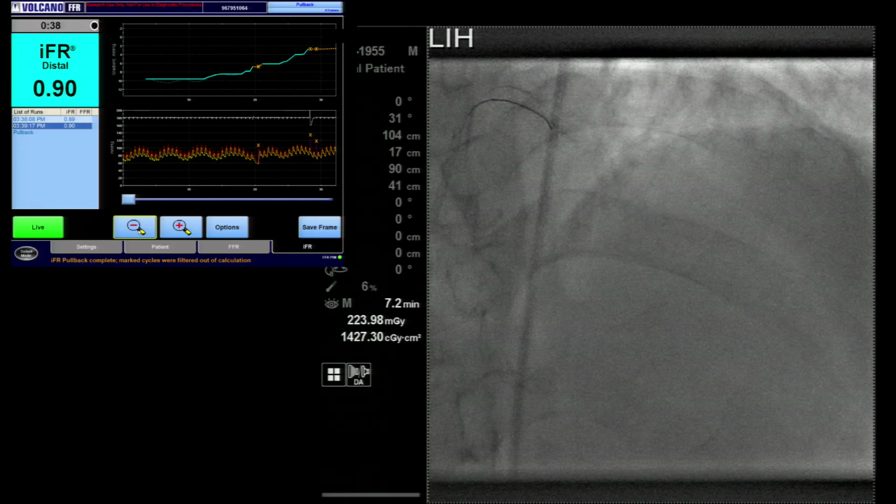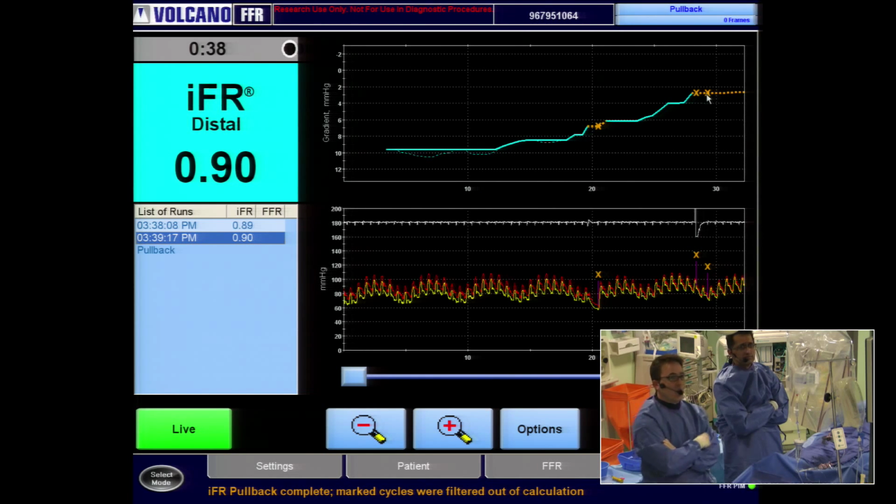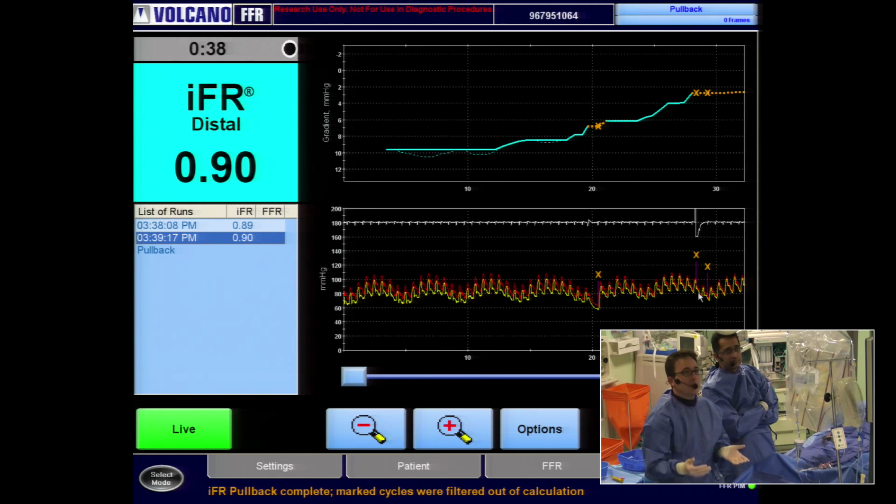Okay, good. As I said, this is state-of-the-art software, and you can see that what the software has actually done is detect a few beats where you had an ectopic beat or a slightly longer beat, and it's put those little red crosses there. It's just a way of us knowing whether the machine is completely comfortable with this beat, or perhaps if it looks funny visually, we could repeat it. But I think that looks great. I think it's just the machine being very, very cautious in this setting.